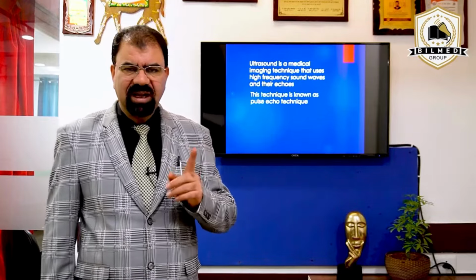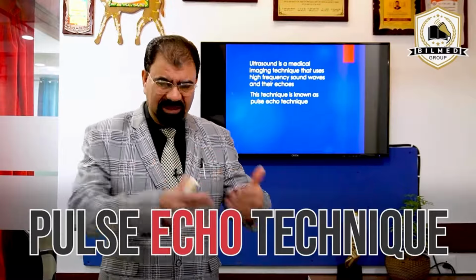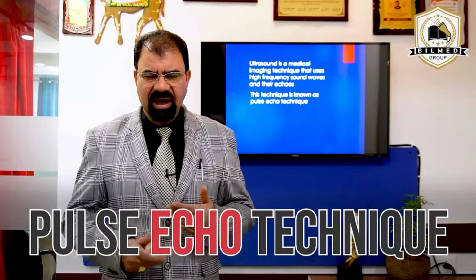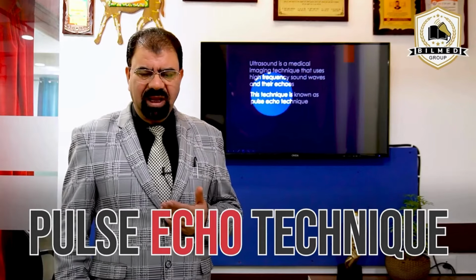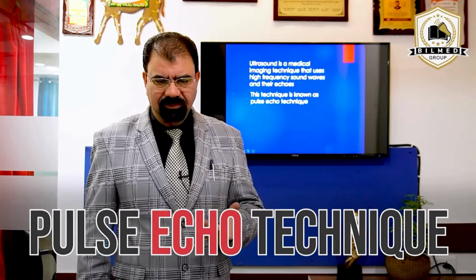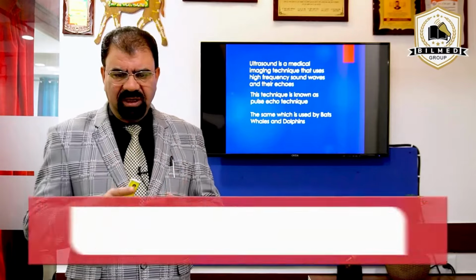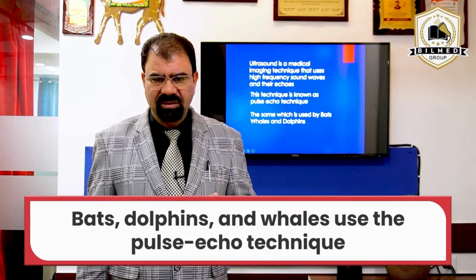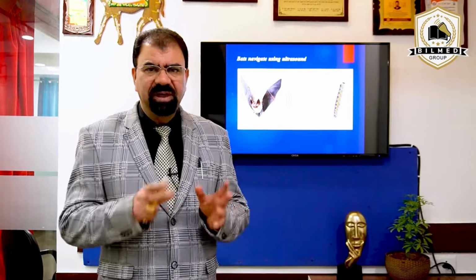Now this technique is called the pulse echo technique. Whatever we send into the body is the pulse, and whatever we receive back is the echo. This is the definition. The technique is known as the pulse echo technique. The same pulse echo technique is used by bats, dolphins and whales. What for? To navigate in the medium.